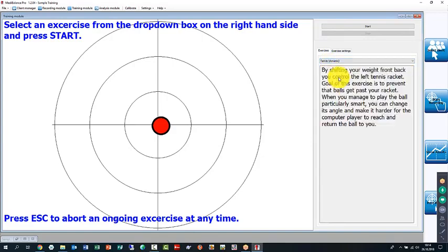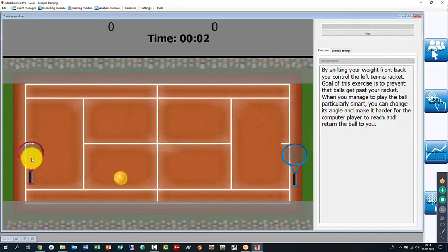Next one is tennis, which is the good old pong. You're represented by the racket on the left-hand side, which goes forward and backward. And on the other side, the blue one is the computer, the KI. And he's playing against you. Now this is all slow motion, and your mission is to move the racket to a point where the ball can't pass you. Oops. And now I didn't do it properly, but the ball actually flew past me, so it's 1-0 for the computer.